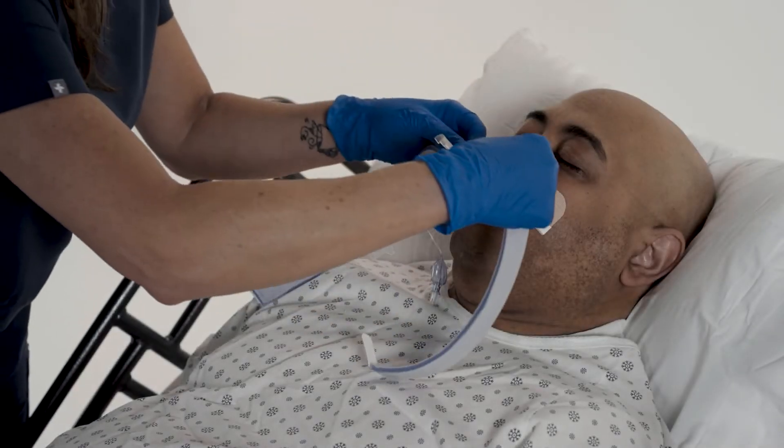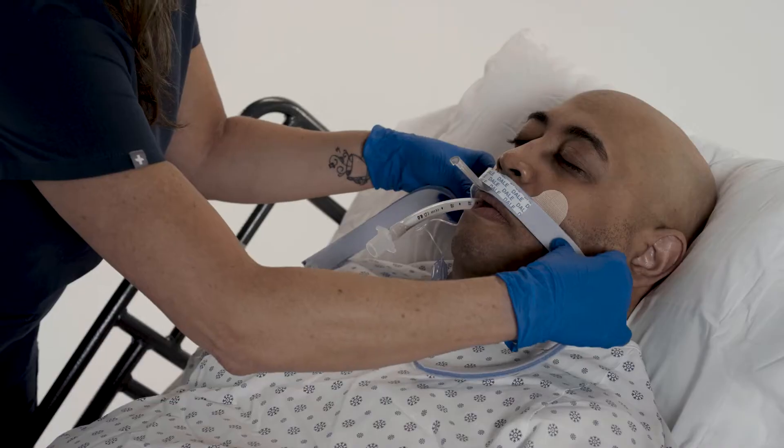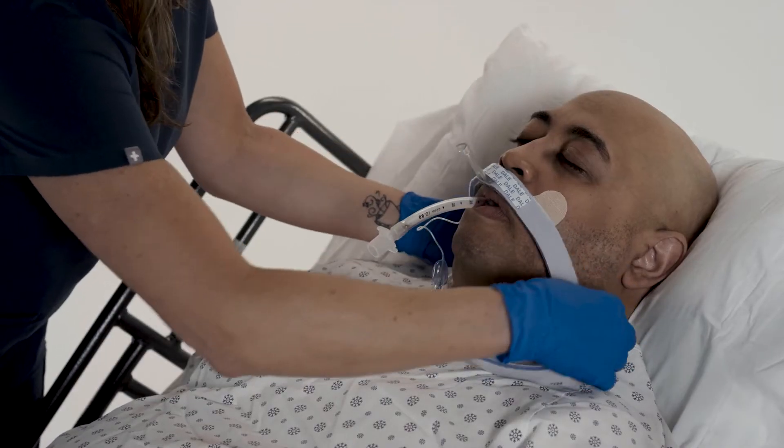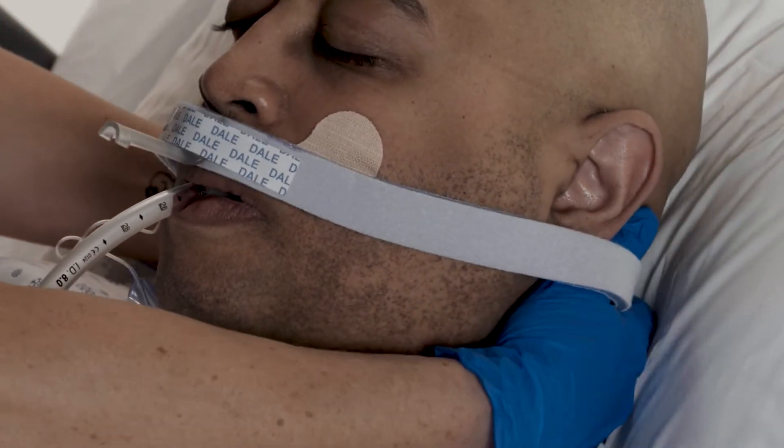Press the neckband onto the hook strip of the adhesive base, making sure the track is centered above the patient's mouth. Draw the ends of the neckband just below the ears and crisscross the band.